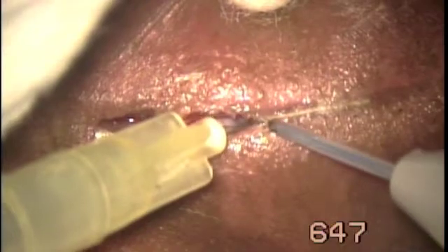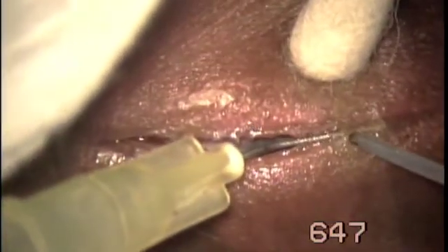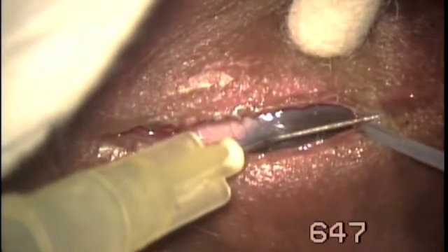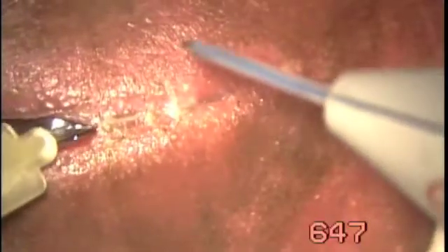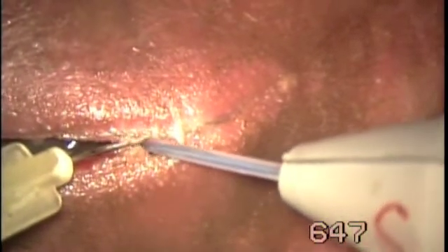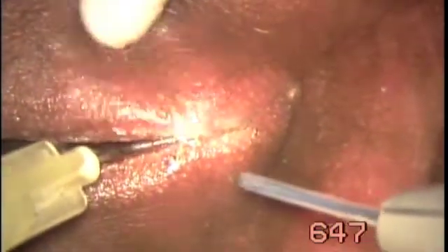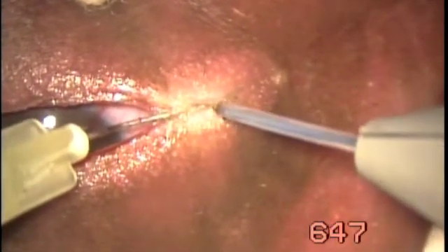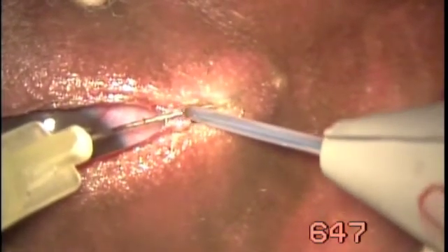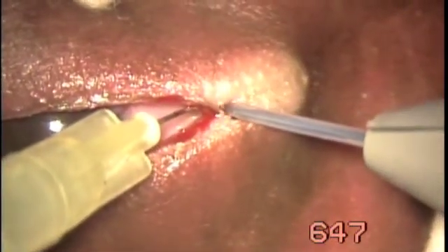Now we cut the fusion in the middle of the lid. One could do it with knife and scissors, but Fugoblade lends simplicity, beauty, and fineness.